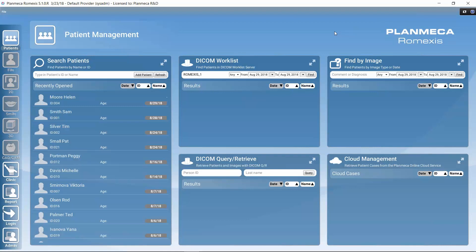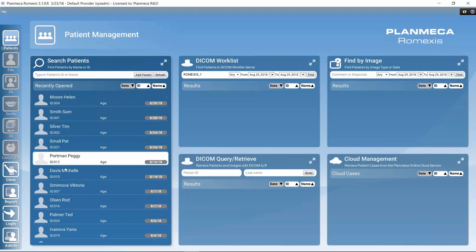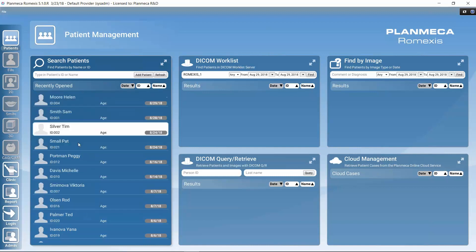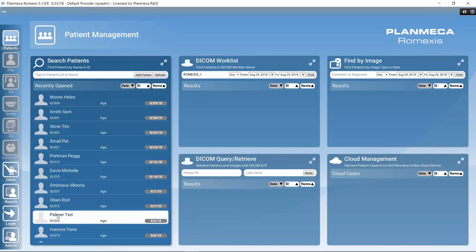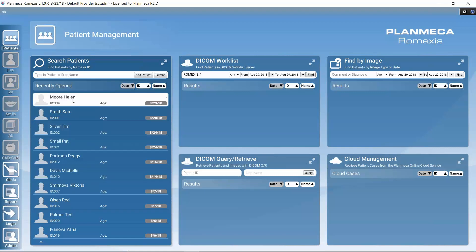That was an overview of PlanMega Romexis. Now we can move on to how to manage patients. Many users manage patients in their practice management software, so this may not be relevant for everyone. We will cover patient management, then look at the report module and a quick look at the admin module as well.